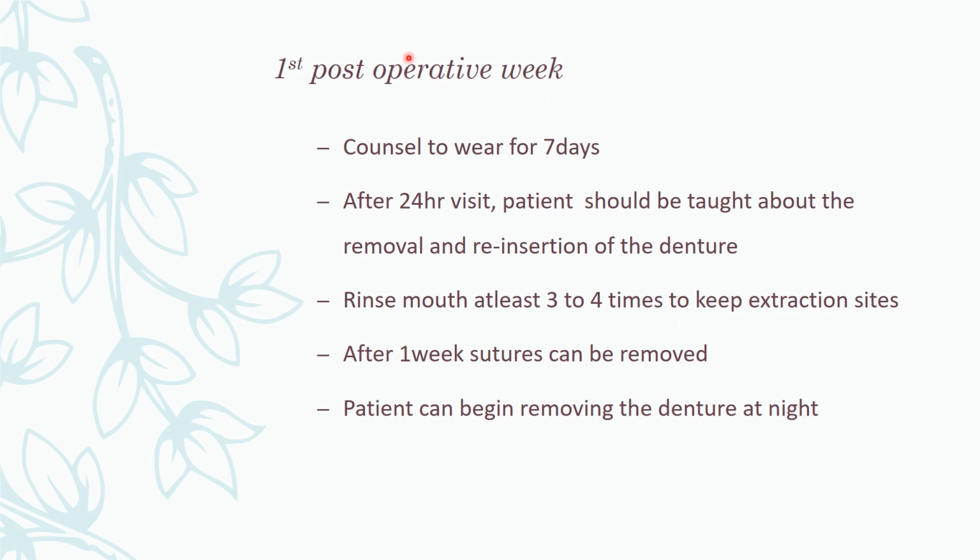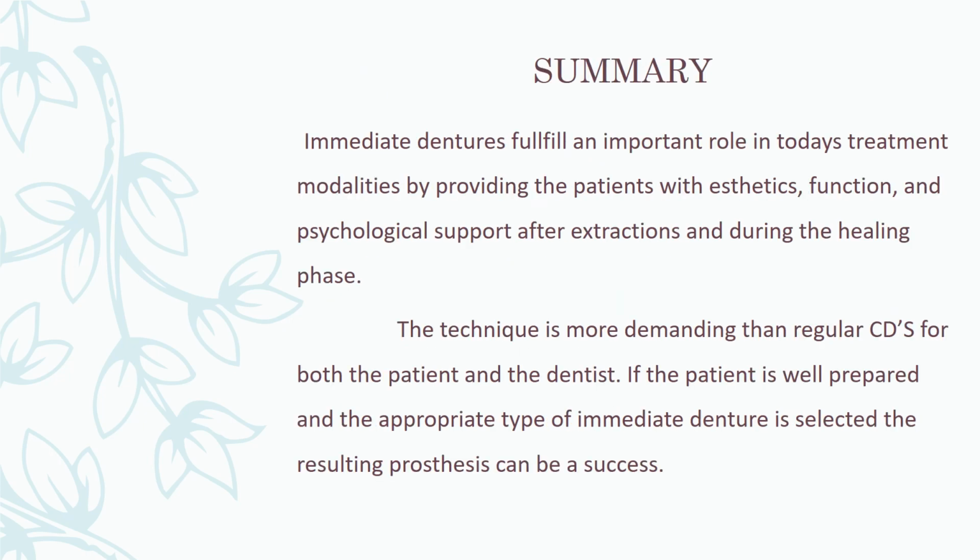The first week after post-operative is usually the normal denture issue instructions we give to a patient after 1 week in a conventional denture. But yes, there is an extraction socket to be taken care of. If any antibiotic regimen has to be continued, it should be. If not, then it should not be required. Okay, so guys, that is it.